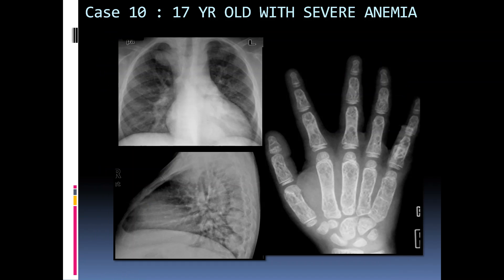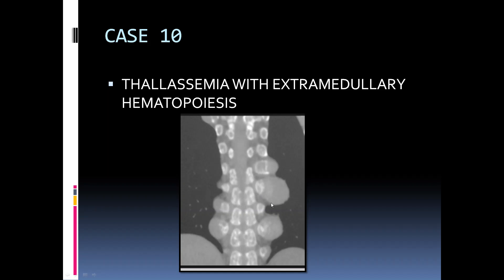This is the last case: a chest radiograph of a 17-year-old with severe anemia shows well-defined lobulated opacity in the right upper zone in the paravertebral location and in the left retrocardiac region, with multiple similar rounded opacities. On the lateral chest radiograph these rounded opacities are located in the posterior mediastinum, and on the hand radiograph there is a trabeculated appearance of all bones along with cortical thinning and medullary expansion. So the diagnosis is extramedullary hematopoiesis in the setting of hemolytic anemia, commonly thalassemia; on CT, the soft tissue masses were confirmed to be arising from the ribs.